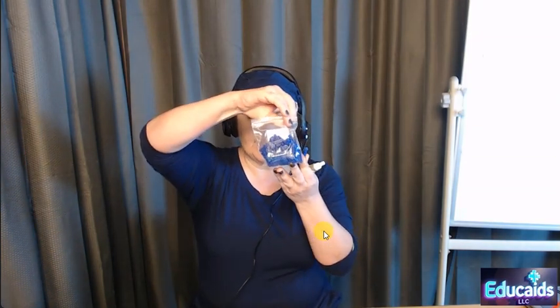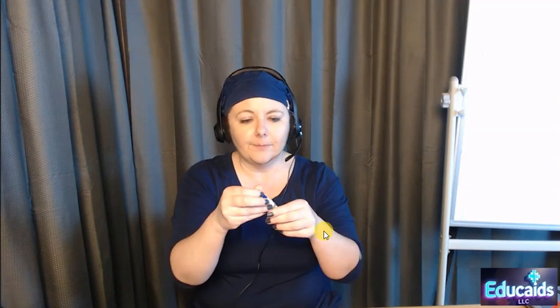So in the hospital, our lancets are single use only. They're in these little pre-filled things that you take off the tip and then you use. Your patient's home lancets are usually a little bit different. They usually come in bags like this that have a lot of little needles in them, and then they go into a reusable kind of sticker like this. And so you load it in, and then this covers the needle, so we twist it off. So you may need to know this because you might have to teach your patients how to check their blood sugar with their home meter before they go home, especially if they're a new diabetic.